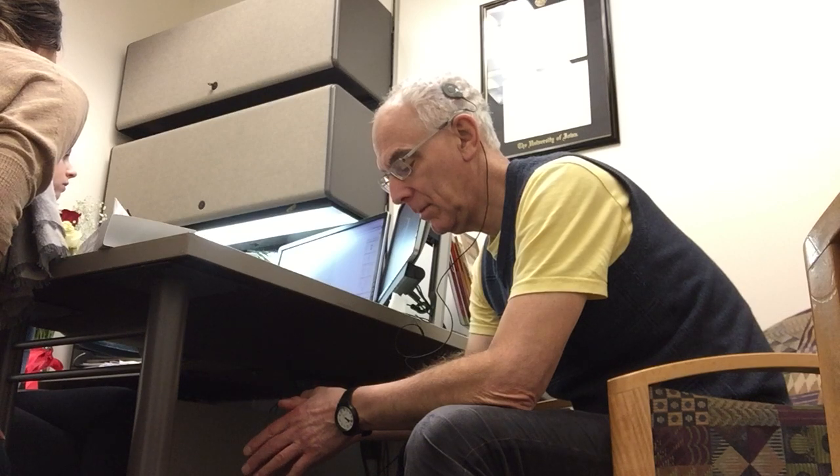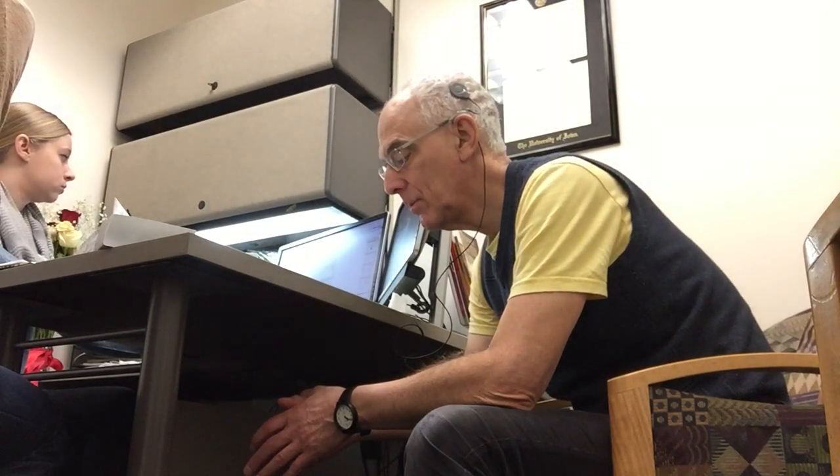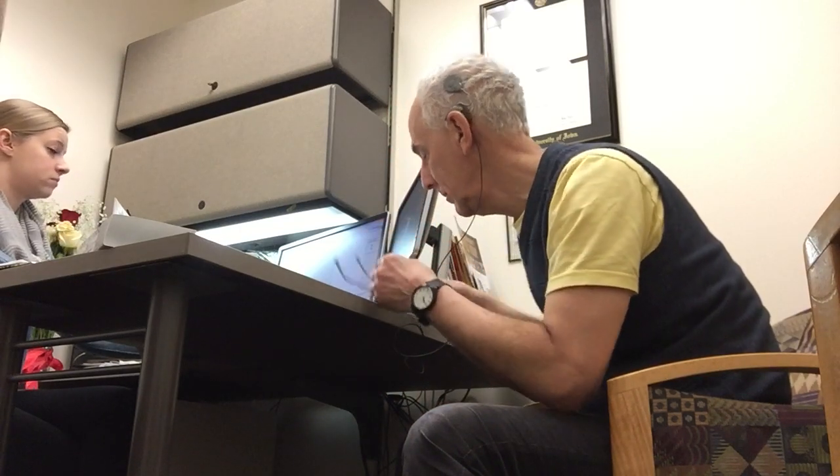And then compliances. Make sure we know where those are. So you said there's no battery in that? Not right now, because you're connected through this cable. Gotcha. Once we're done with all these sounds that you're going to hear, before we turn it on for you to hear us in the room with it, we'll let you know. Okay. Okay, here come some beeps, okay?